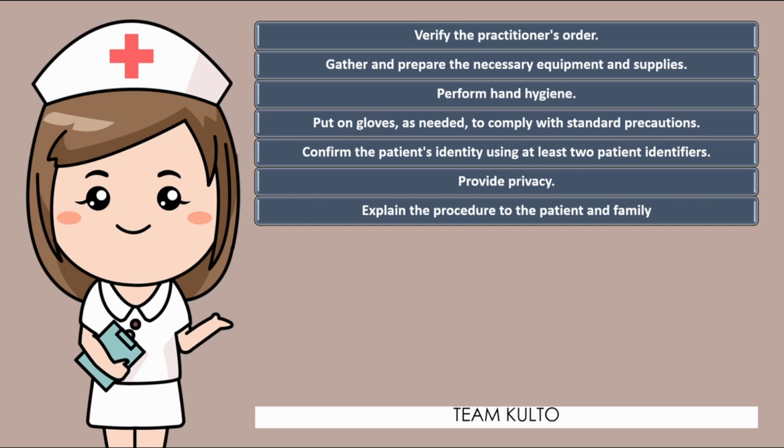This is actually gonna make increase patient cooperation, and this is one way for you to establish rapport to your patients. Minsan kasi yung mga pasyente natin na ginagawa ng ECG, first time nila yon, hindi nila alam, akala nila masakit, akala nila may kuryente. You just have to explain to them that this is painless, I'm not gonna give you any electricity in your body. All you gotta do is to breathe normally, and that way ease sila, and you will gain patient cooperation.